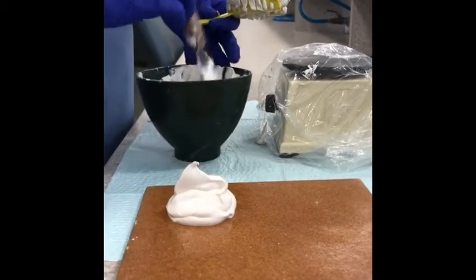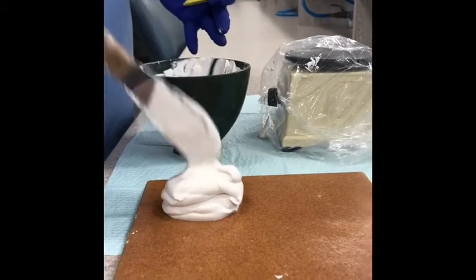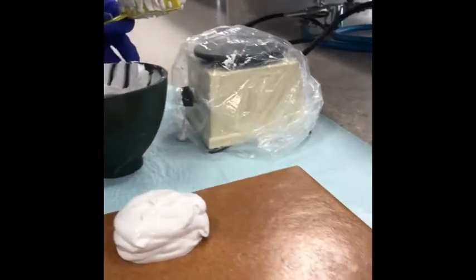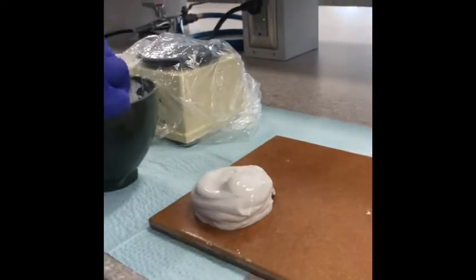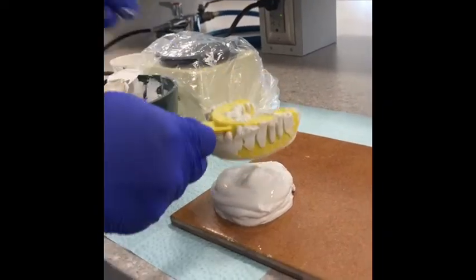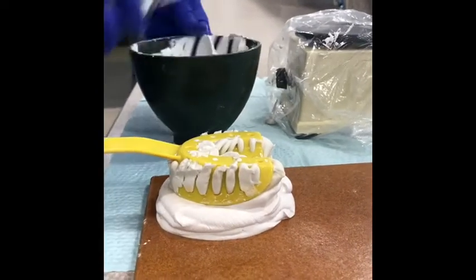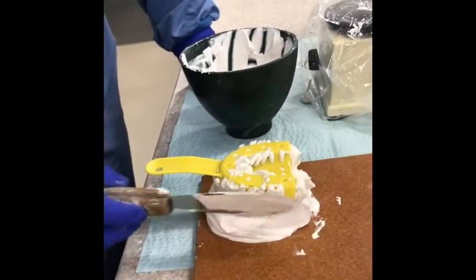Pile quite a bit of plaster on your tile because you'll have a lot of excess in your bowl. Our goal is to get about an inch or so of a base. Then take your impression — already filled up with plaster to the top — and flip it over inverted onto the pile. Give it just a small little push so that smushes the plaster together, then take your spatula and just pull it up onto the impression.